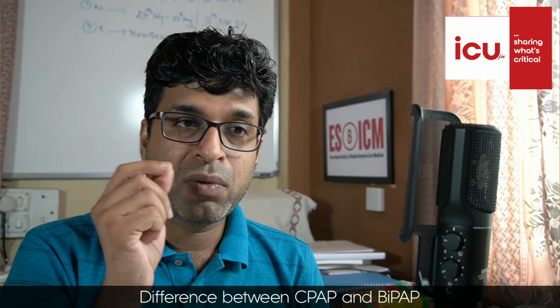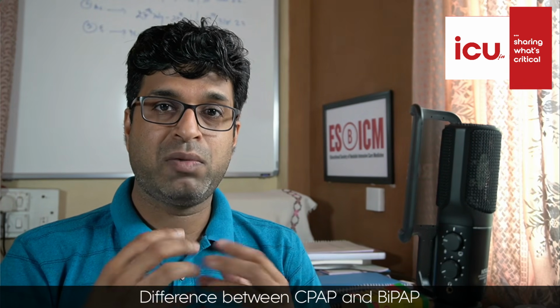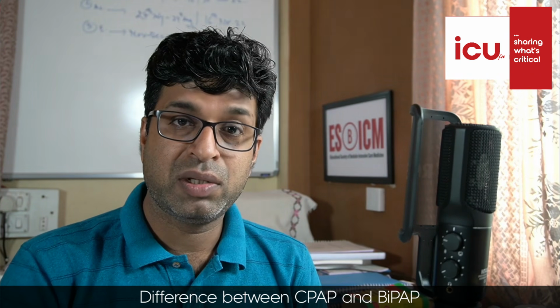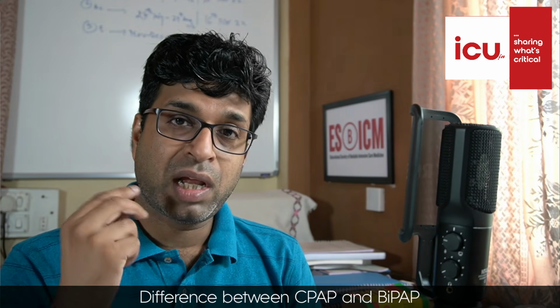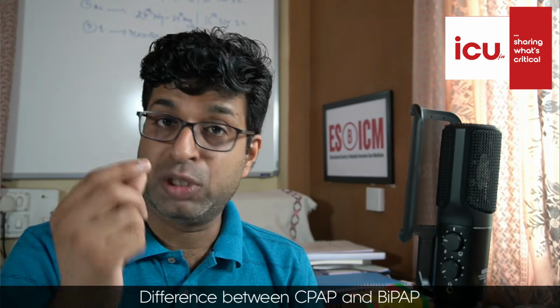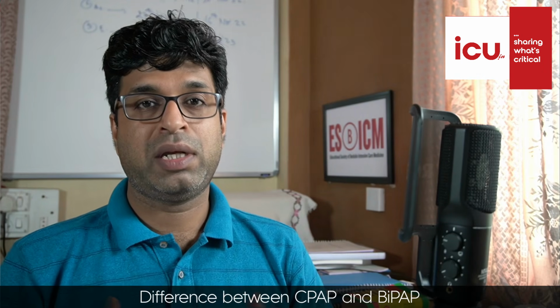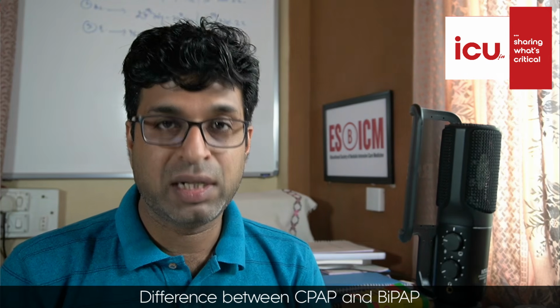Secondly, what you want to do with the patient: whether the primary requirement is oxygenation or ventilation. Oxygenation means the patient is hypoxic, there is hypoxemia, and you need to increase the oxygen level in the blood of the patient. By ventilation we mean CO2. Ventilation means the chest is expanding and collapsing nicely so that your CO2 is getting properly exhaled during the respiratory cycle.